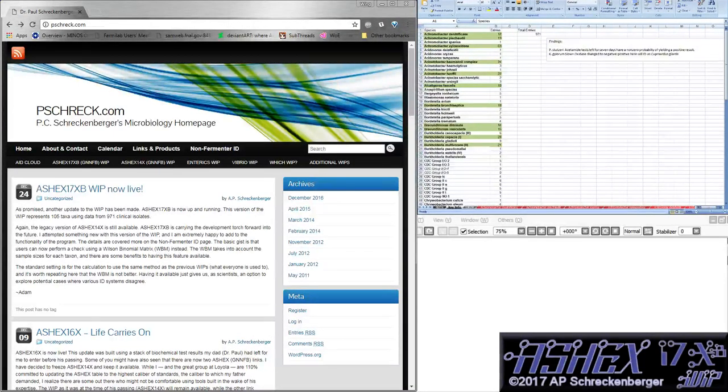I've been collecting some new non-fermenter data from Loyola University Medical Center to gear up for an ASHEX 18XB release. And then it occurred to me that it's been about 4 years since I've done a tutorial, and a lot of things have changed, and the style of the site is now different, so I would like to do a new one.